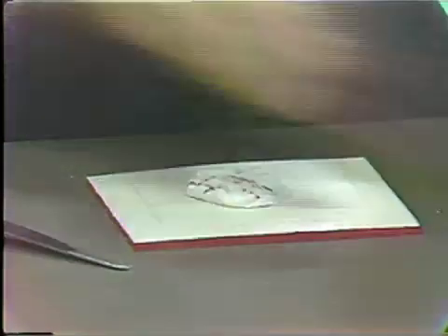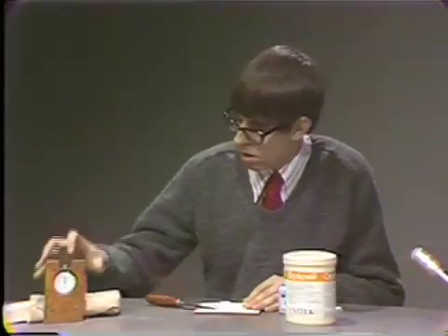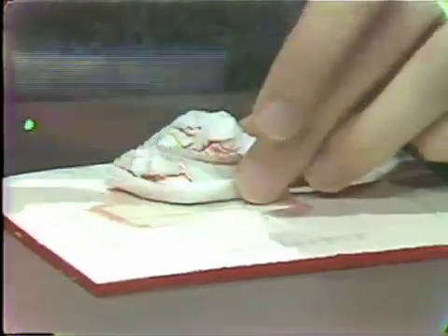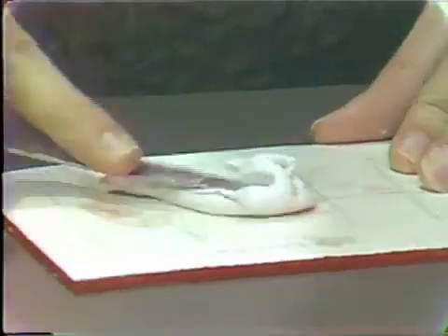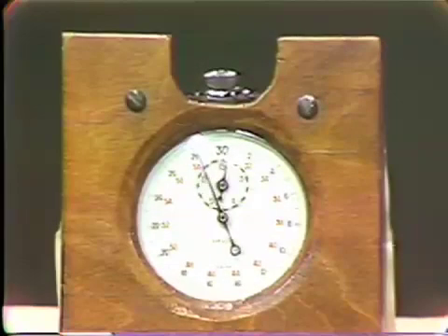This material should be mixed for a minimum of thirty seconds with the spatula, and then can be further mixed using the fingers. We use a folding action to incorporate the catalyst into the putty, picking up the excess accelerator from the pad. Once no orange color is evident in the mix, the putty is ready for loading.